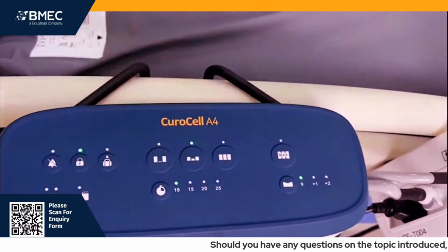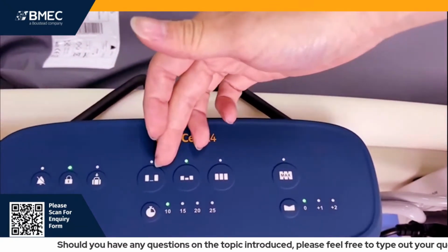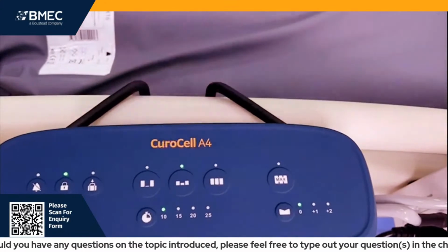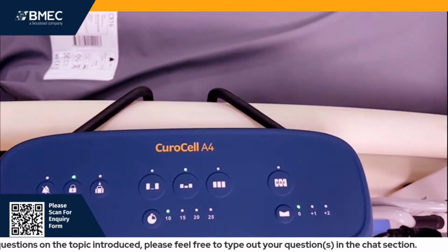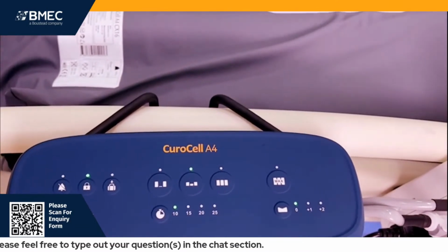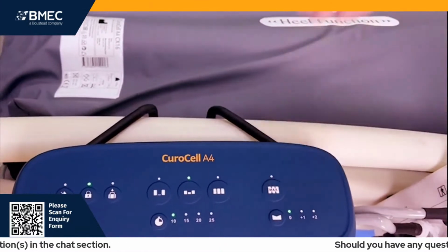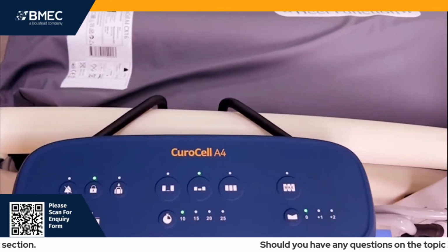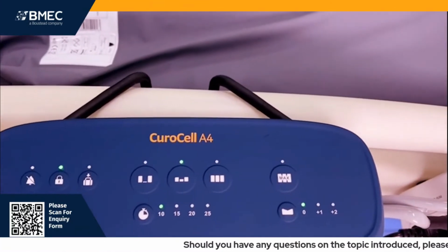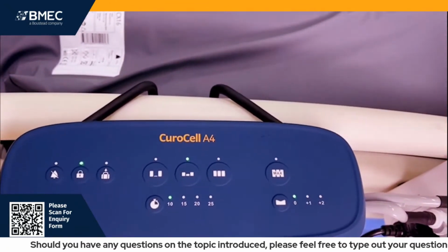Coming over to the timer button, it will be a cycle setting, meaning for the alternating and the pulsating feature, the slightly deflated one would take around 10 minutes, 15 minutes, and so on to deflate accordingly. As for this, it means the pressure button, meaning if you want more pressure, simply increase by 1 or by 2, and then the pressure will be increased.